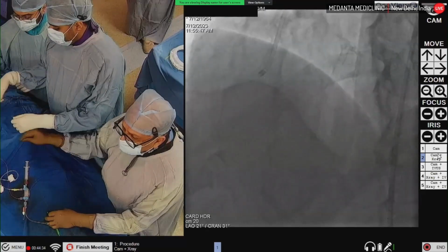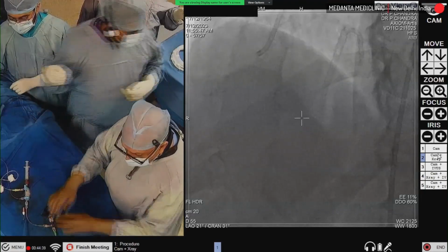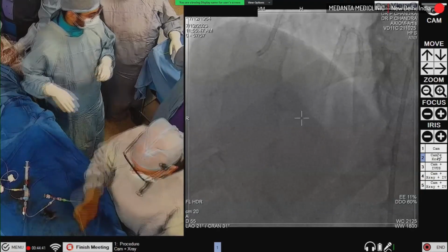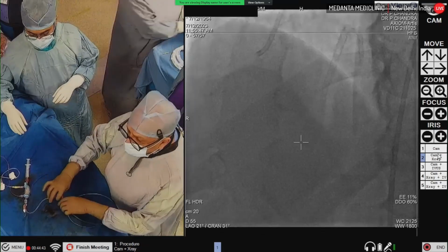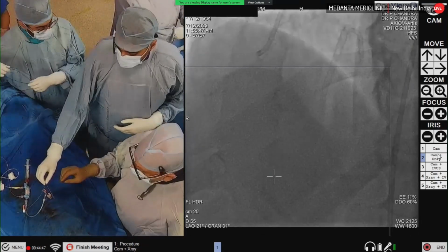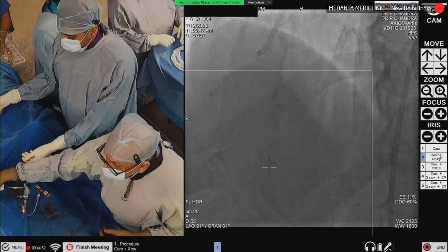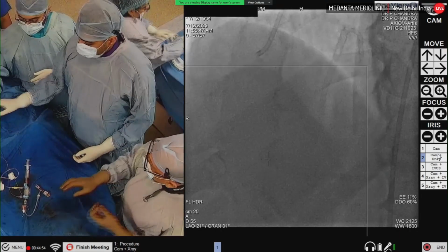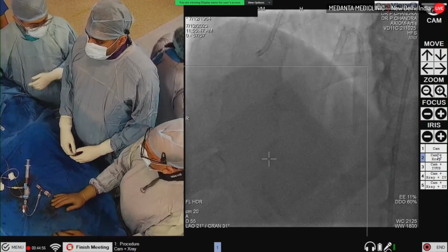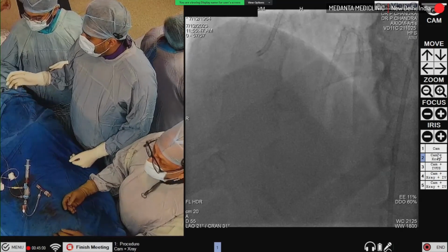Is there any question on the? Please take this. Yeah. So I'll take this RCA catheter out, and we'll go to the left system now. The left system we had stented several years back, and all the stents are doing fine. But he has some distal disease in the LAD segment, which I'm going to show you. So give me a left guiding catheter.